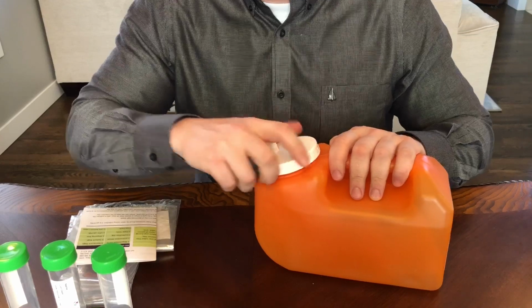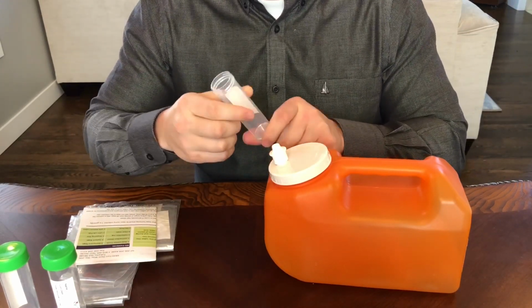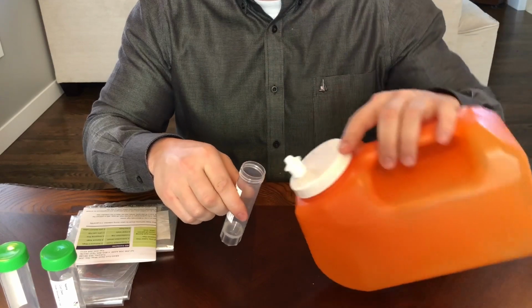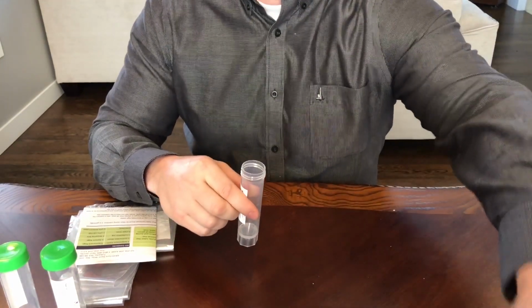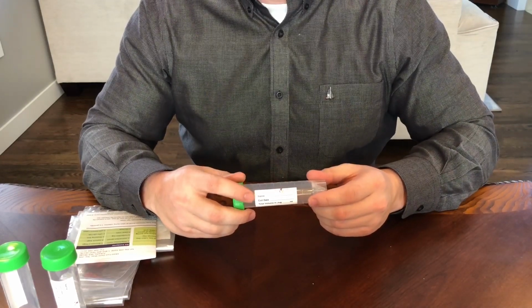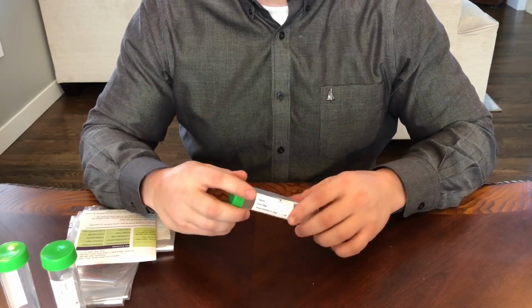Secure the lid on the jug and pour the urine into 3 vials up to the upper 40 milliliter line. Discard the remainder of the urine. Make sure all labels have name, date of collection, and total volume of the 24-hour urine collection.